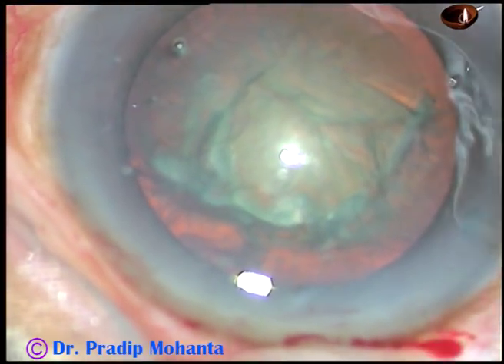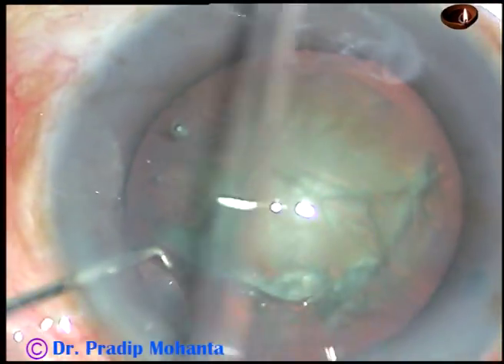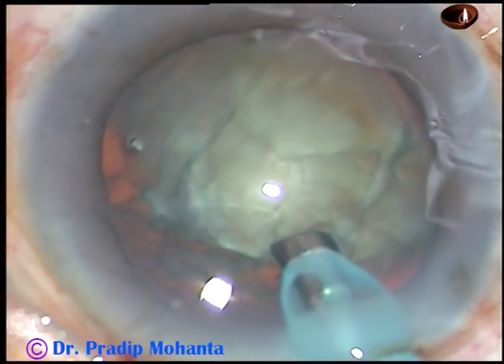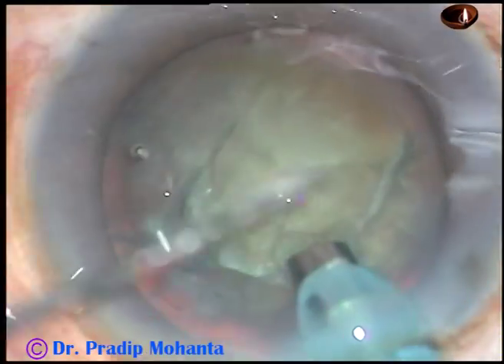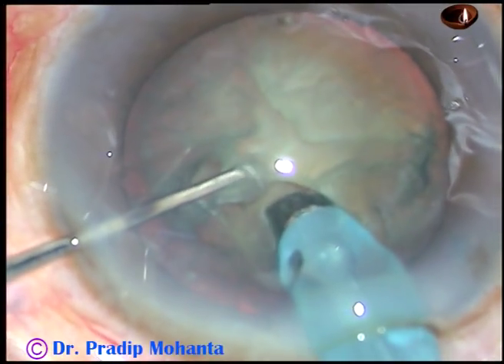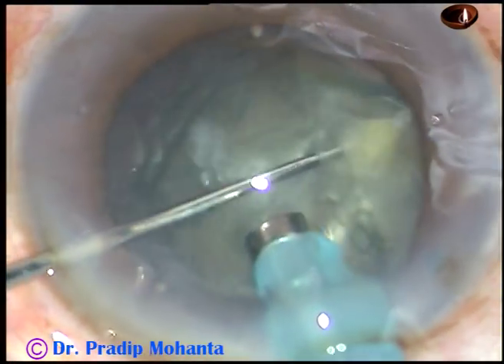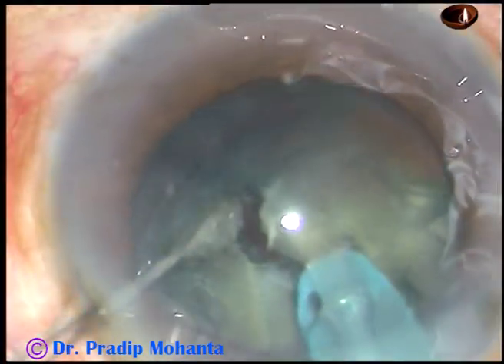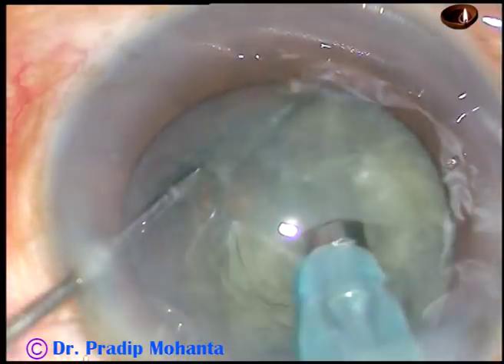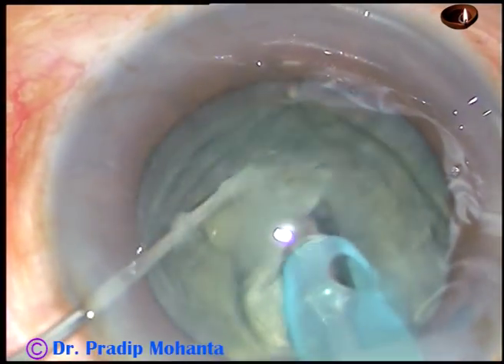And here goes the tip of the phaco handpiece. It is introduced bevel down. Turn the tip — don't clean the superficial cortical matter because the anterior chamber is very shallow. And here, I go into the substance of the nucleus and go through it for a distance, and then chop it. The key is you hold the nucleus very firmly, go for a distance, come back to position 2 — that is vacuum — and hold the nuclear mass very firmly, and then chop.